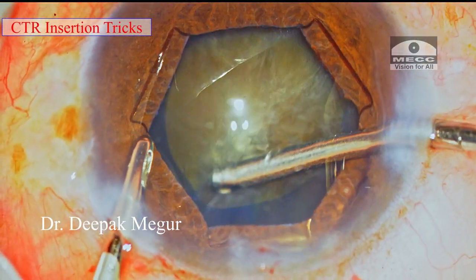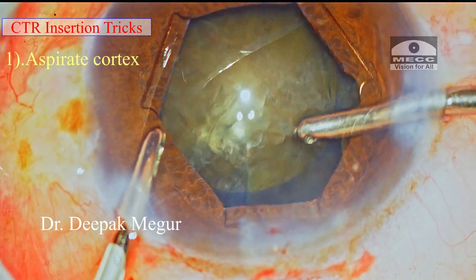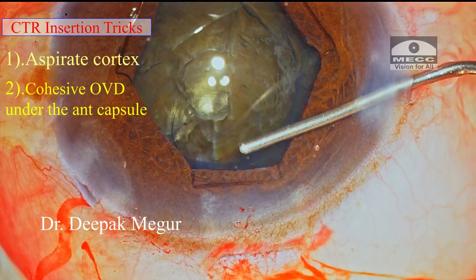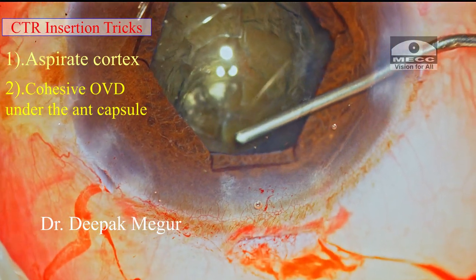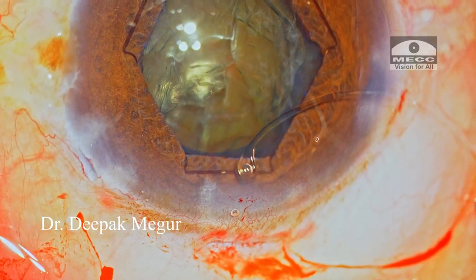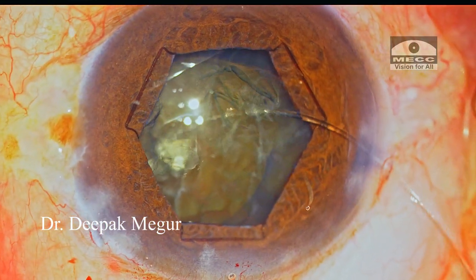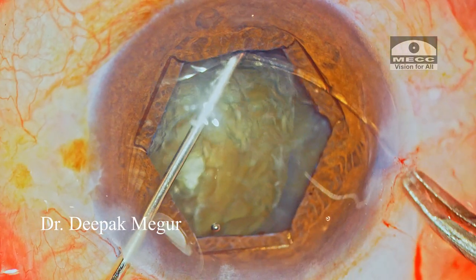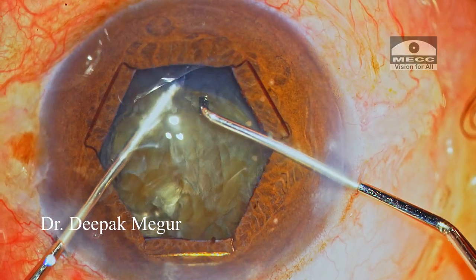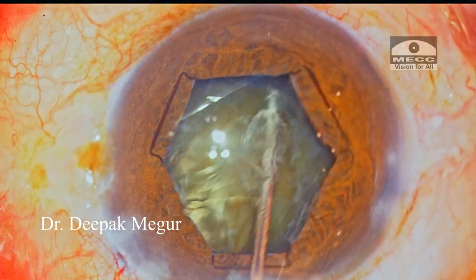A few tricks while inserting the CTR: I first aspirate the cortex in the area of introduction of the CTR under the anterior capsule, and then I create some space under the capsule using cohesive OVD. The CTR is inserted quite easily. I always prefer the bimanual technique — the non-dominant hand supports the ring so it can be introduced without putting any stress on the zonules. Once we have the CTR in the bag, it's like having won half the battle.